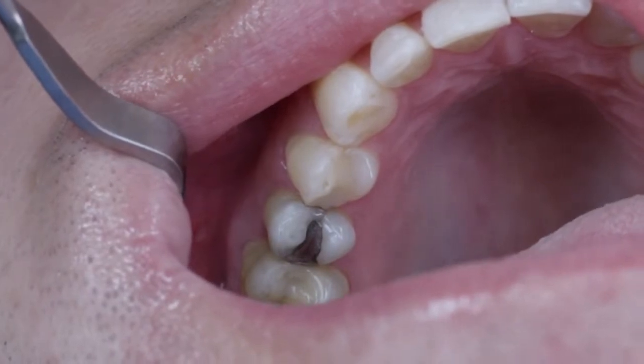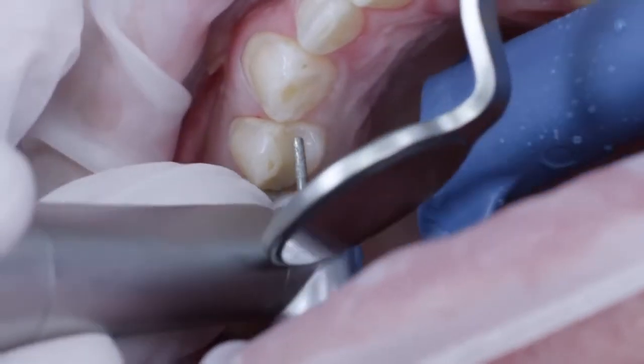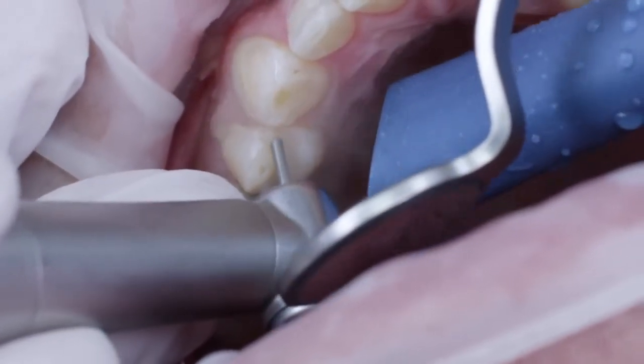I chose a combination of Venus Bulk Fill and Venus Pearl, as Venus Bulk Fill allows cavities to be filled quickly in increments of 4 millimeters. This convenient bulk fill technique helps a lot to save time for posterior restorations.